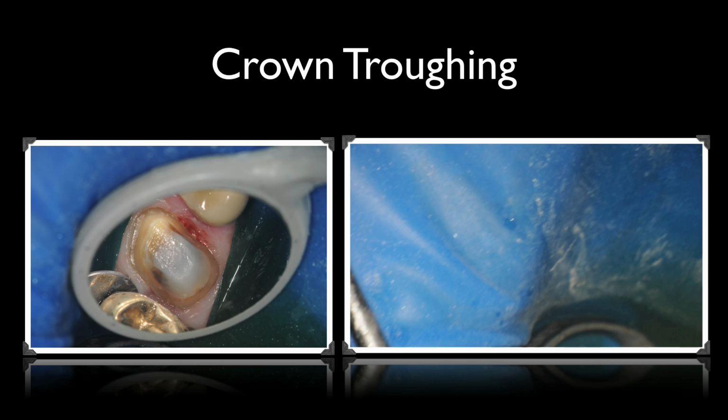Again, you can see the amount of fiber that is extruded. If you look, you can see the metal cannula, then the Teflon or the coating on the fiber, the cladding, the insulation, and finally the last little bit of the fiber that is exposed with the initiated tip. Again, you can see that you're not getting any bleeding. In fact, we've stopped the bleeding that was happening on the mesial after the crown was cut off because of the deep preparation. And we're now going towards the palatal aspect, again in short brush strokes.